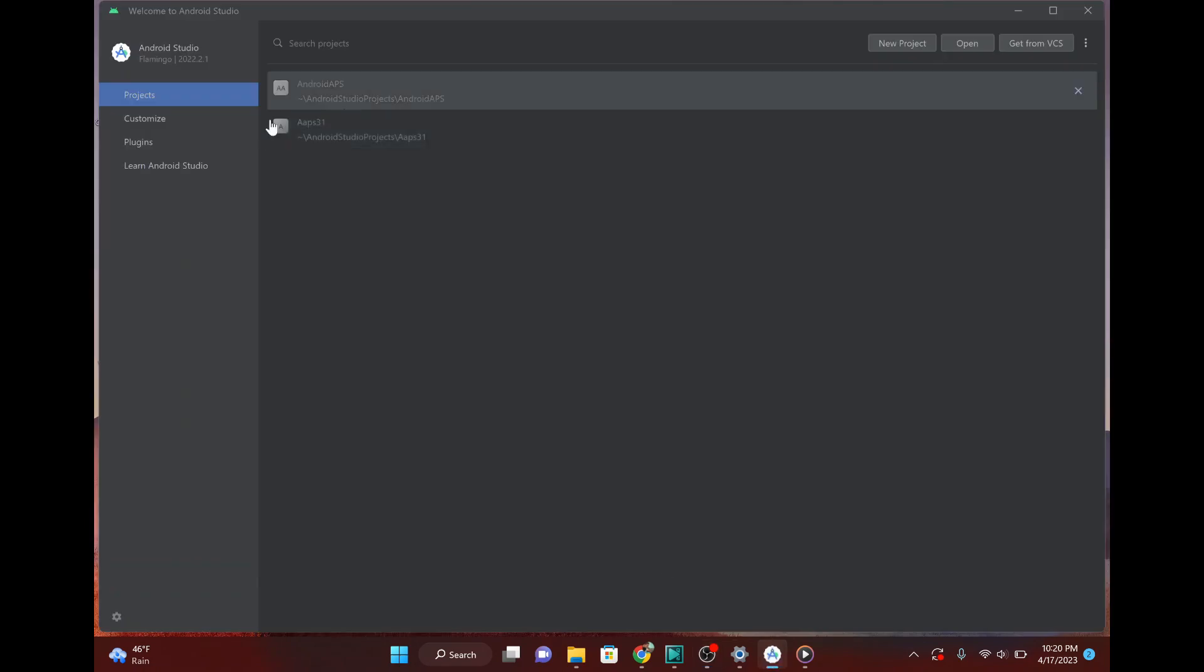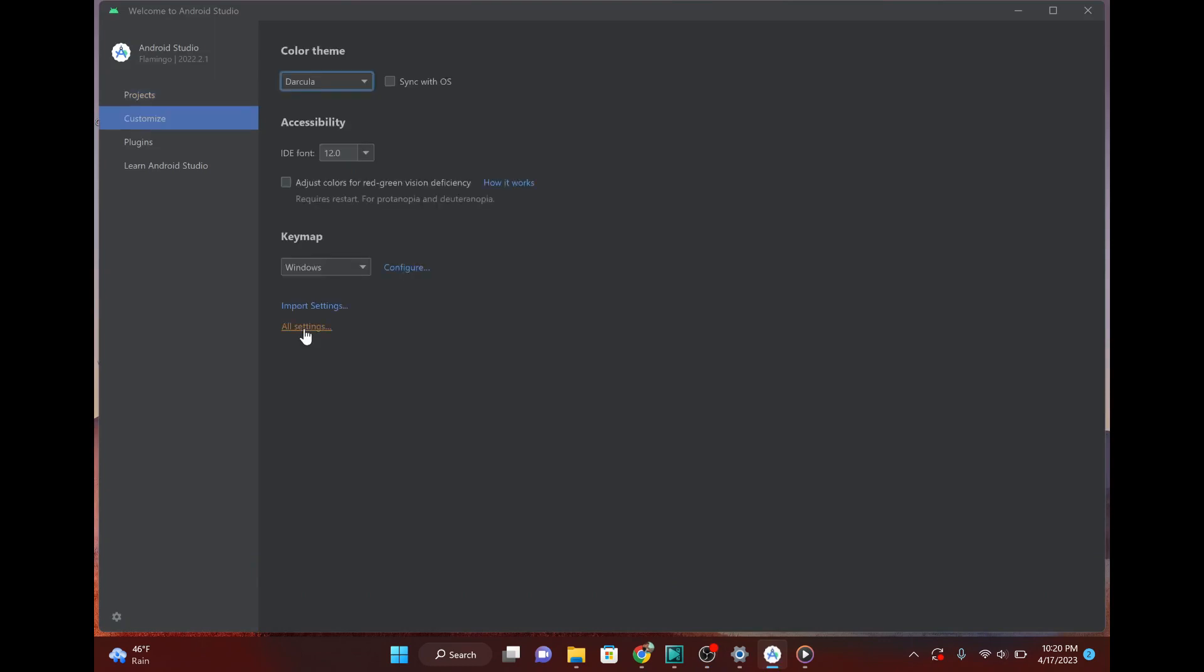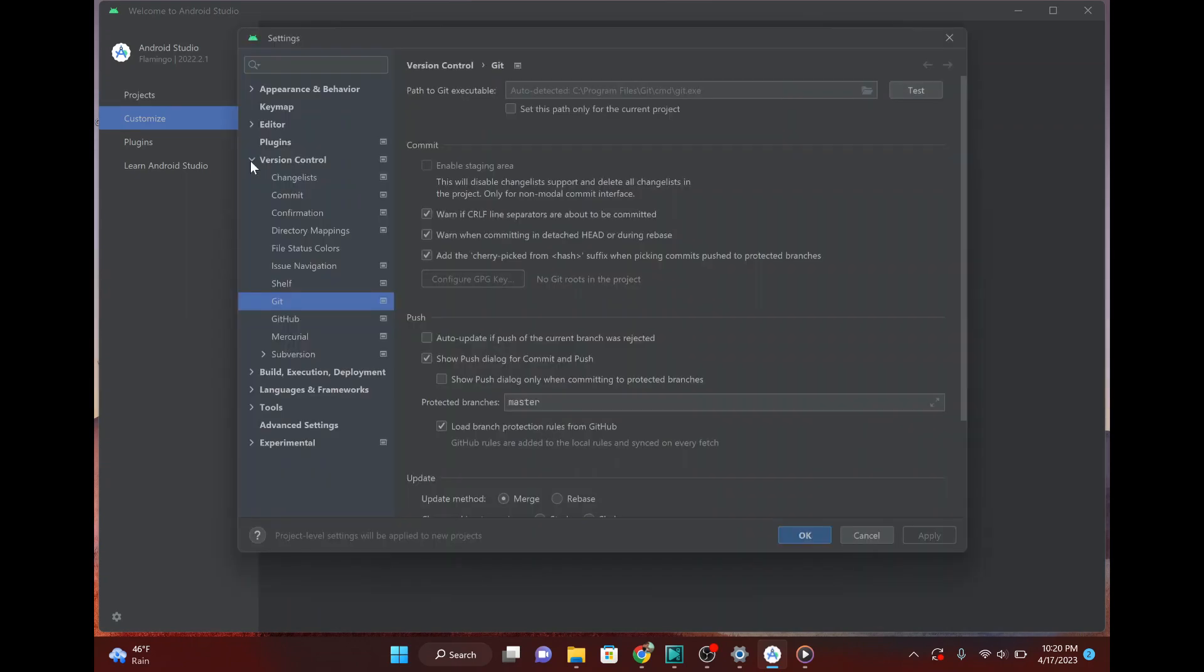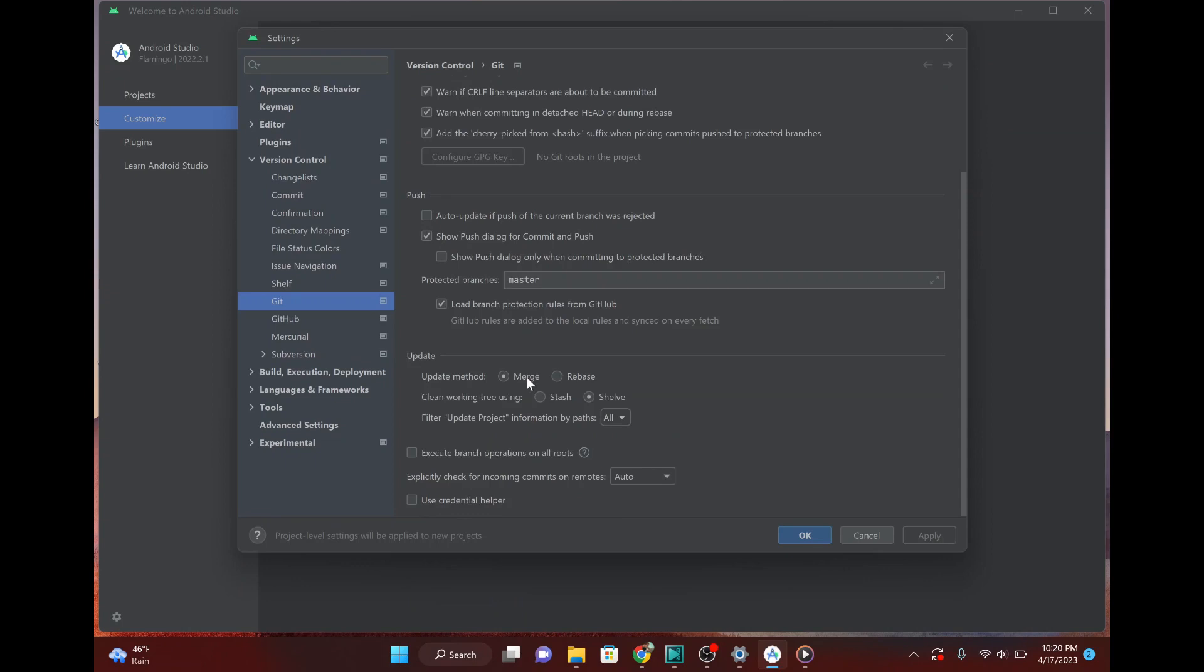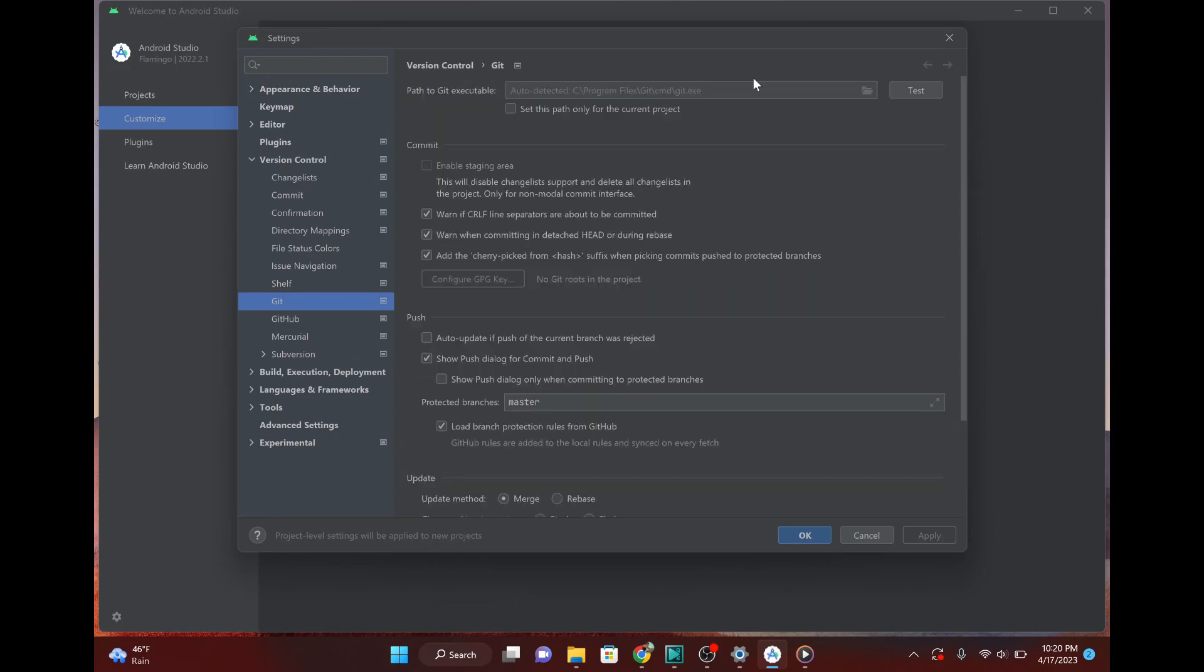Okay. So now that we got Android Studio installed. First thing that we want to do is we want to go to this customize. And then hit all settings. What you want to do is go to version control. And then Git. And the big thing that you want to check is make sure that update method is set to merge, which it was, and then make sure.